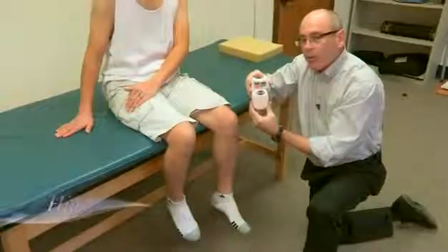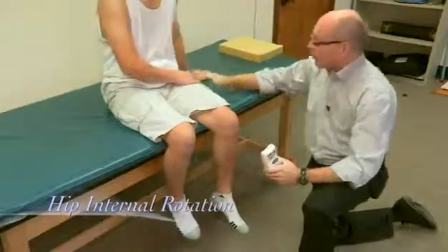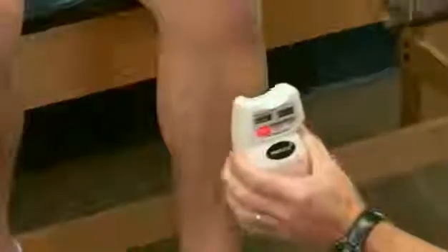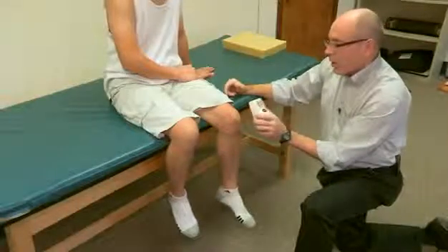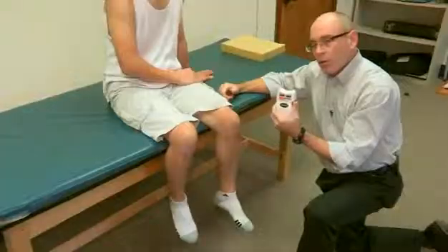We can continue by looking at internal rotation. He shifts the position of his upper limbs accordingly. I reset the inclinometer and he rotates the other way as far as he can. What I ended up with was 33 degrees of hip internal rotation.